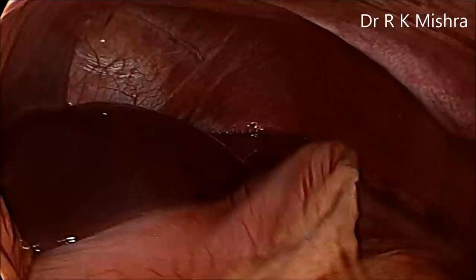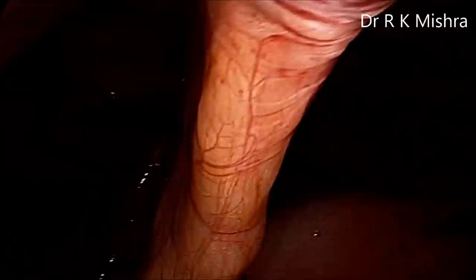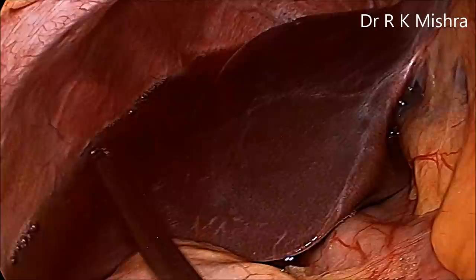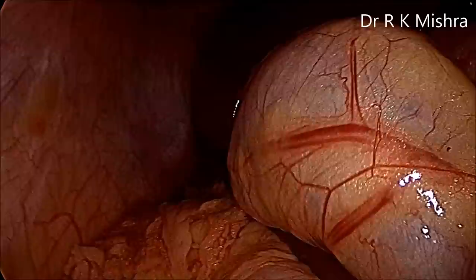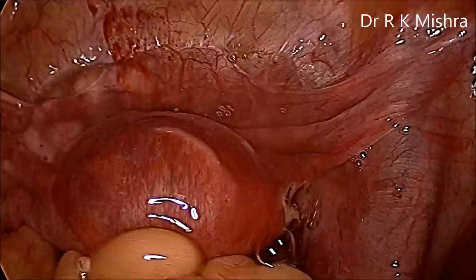This is the splenic area, left lobe of the liver, stomach, falciform ligament, and again the sub-diaphragmatic area and Morrison's pouch. Thorough lavage was performed and the entire abdominal cavity was cleaned out. Going back to the pelvis, repeated lavage was performed. The fluid is now fresh because almost all the blood has been removed.